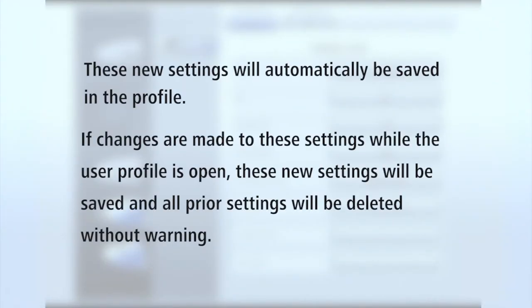These new settings will automatically be saved in the profile. If changes are made to these settings while the user profile is open, these new settings will be saved and all prior settings will be deleted without warning.